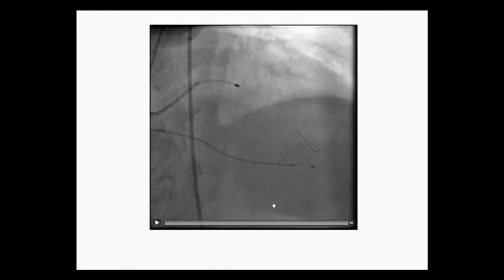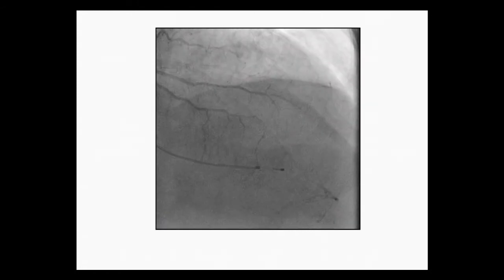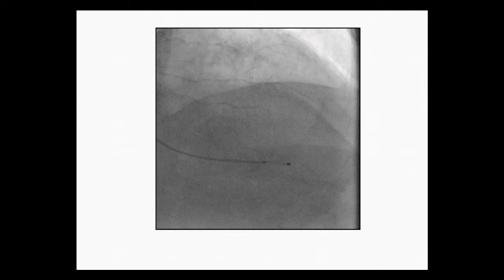So this is what we did. This is the rota of the LAD, and this is the final. Did you load her again? No, just Plavix, 75 milligrams. What did you use during the procedure? Not just cangrelor and aspirin.